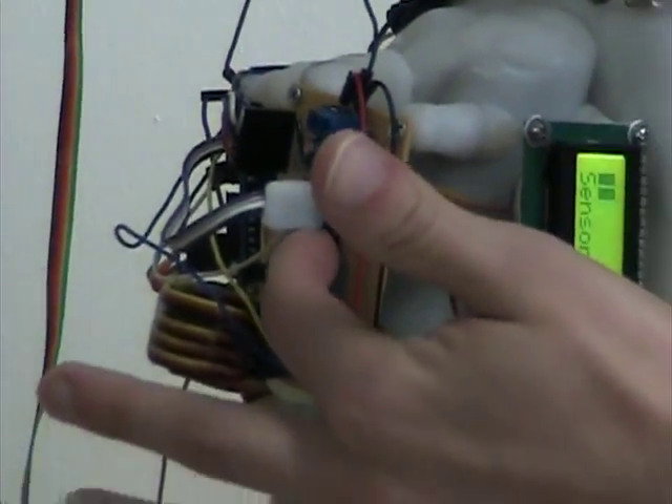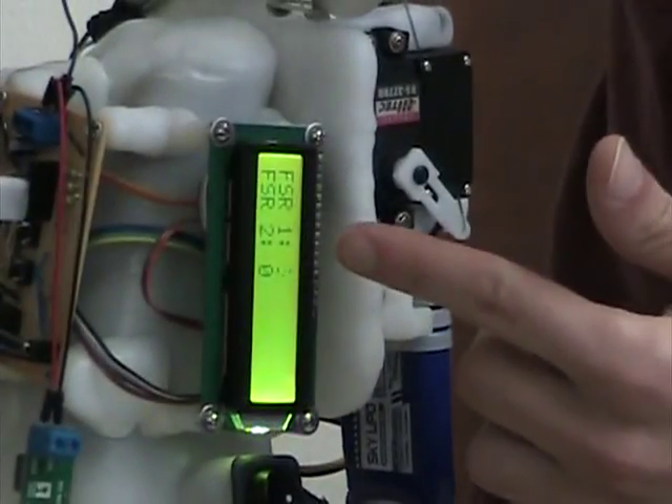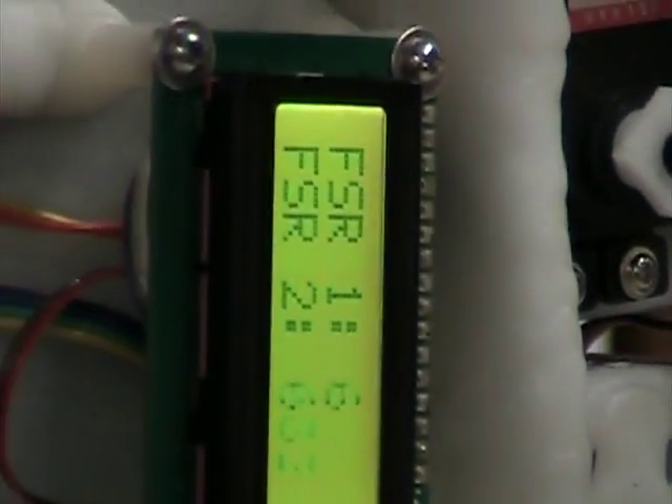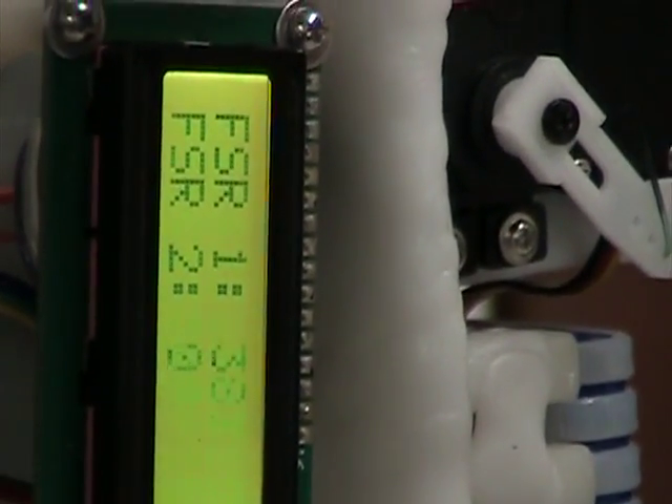Sensor 1, 2, 3. It displays force sensitive resistor information. So these two pads here are force sensitive resistors.